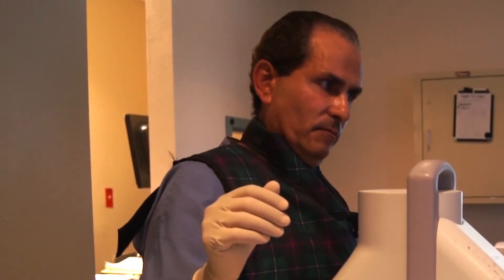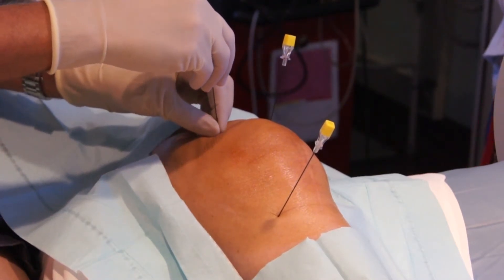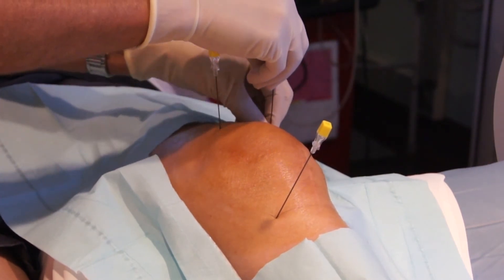The patient is slightly sedated. We now have the needle placed exactly where we want it, around the genicular nerves. We are going to perform sensory and motor testing to make sure we are targeting the right nerves, and after that we will numb the nerves before doing the radiofrequency lesion or cauterization.